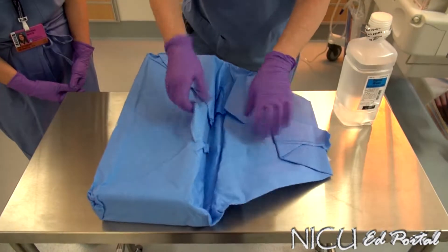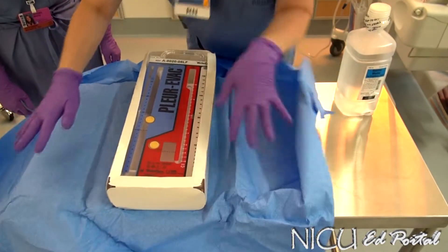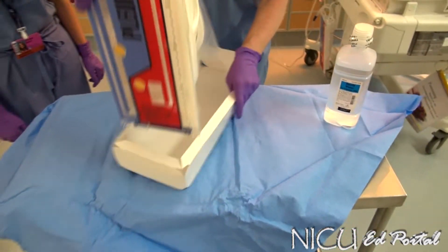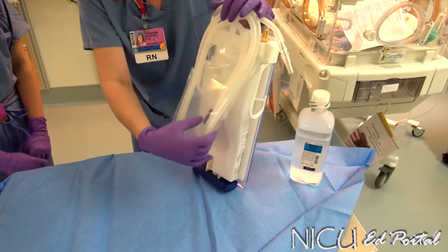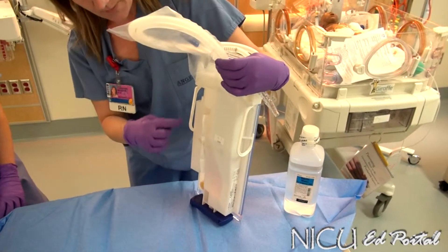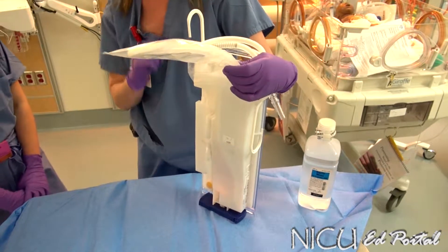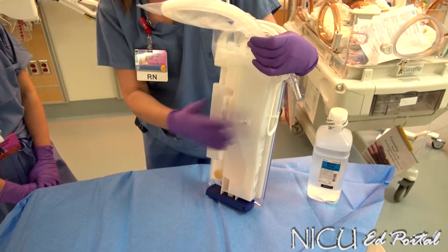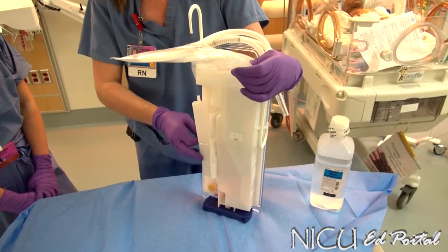I'm going to open this up and take the drainage system out. The back has some very important items that you want to make sure you don't throw out inadvertently. It has a funnel attached to it — that's what we're going to use to fill our water seal chamber. You also have an adapter here, which you may need when setting up a chest tube. Make sure those items are preserved and not thrown out.